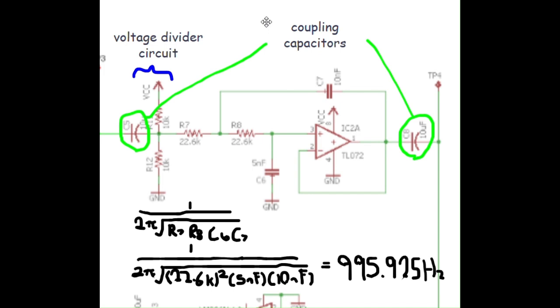This configuration is used to filter for a certain range of frequencies. It allows only low frequencies to pass through, but not high frequencies, to isolate the important biological sounds and remove unwanted noise. How do I know it's a low pass filter? It's because of how the resistors and capacitors are arranged, with R8 being here and C6 being here. If it was the opposite position, it would be a high pass filter.